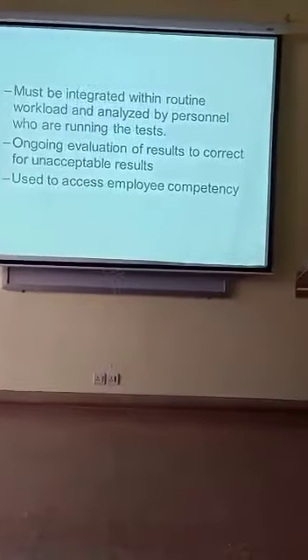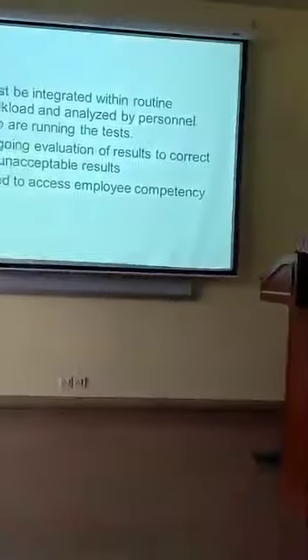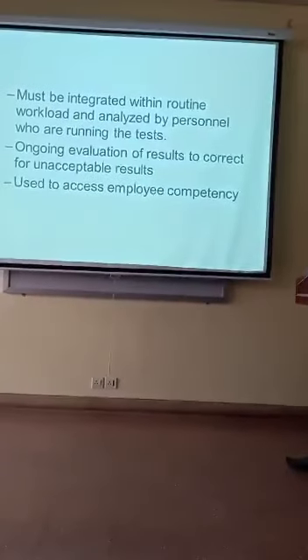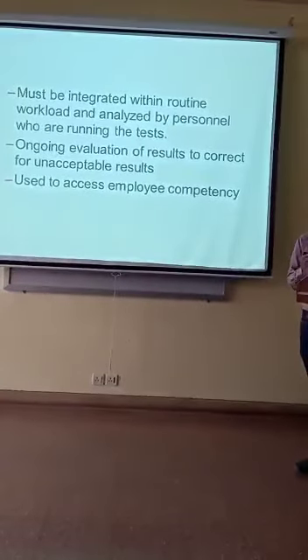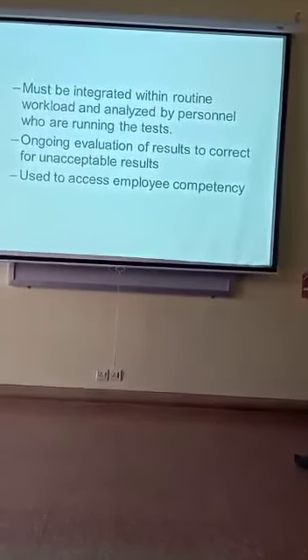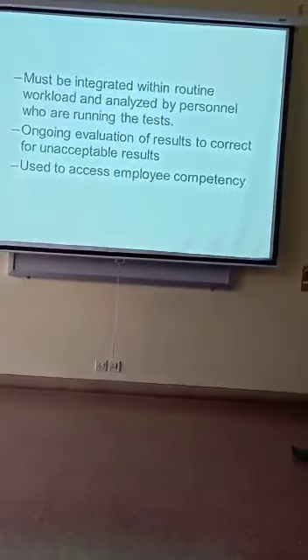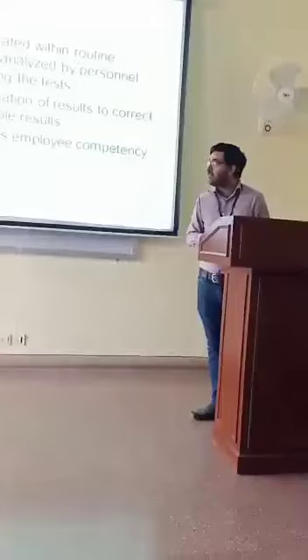These external quality control program specimens must be integrated within the routine workload and analyzed by persons who are running the test routinely in our lab. There is ongoing evaluation of results to correct for unacceptable results, and it is used to assess employee competency.